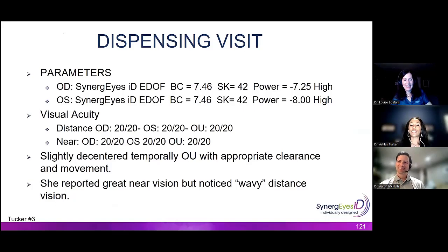Yeah. So the visual acuity, this was actually my very first patient using the EDOF for myopia management. So I was so pleased when I saw that her distance acuity was 20/20, her near acuity was 20/20. She was really happy. I didn't press the issue of what the patient was actually getting into. I didn't set the stage that you might be a little blurry up close, or you might be a little blurry at distance. I just told her I was putting her in a lens that was going to help her visually and hopefully reduce her myopia progression. So I didn't want to plant any negative seeds about the potential vision issues here.